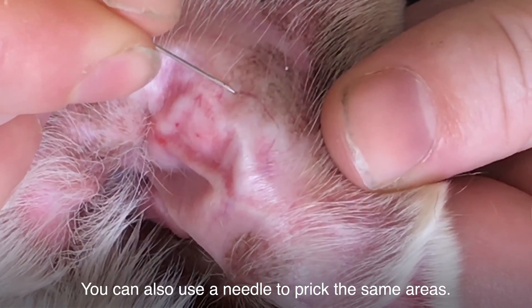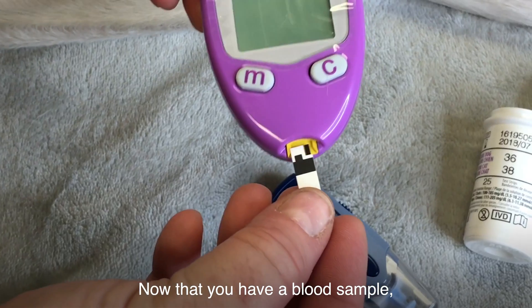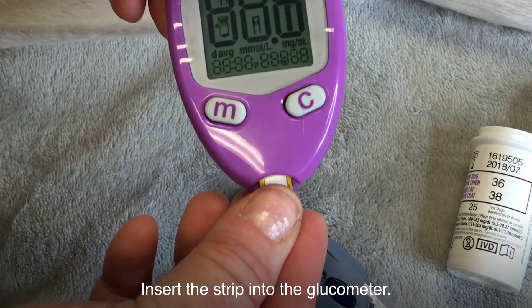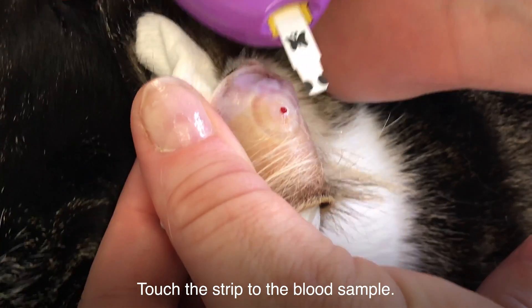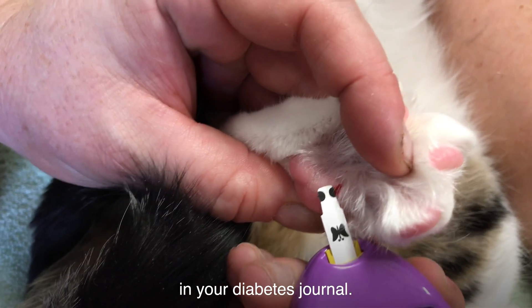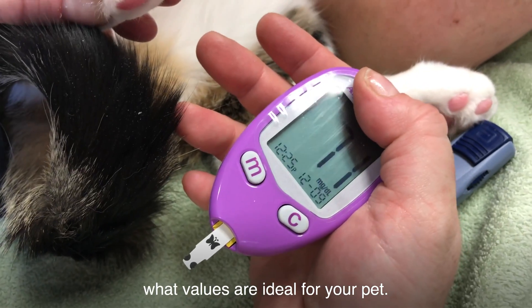Apply firm pressure. You can also use a needle to prick the same areas. Now that you have a blood sample, it's time to use the monitor. Insert the strip into the glucometer. Touch the strip to the blood sample. Wait for the value and record it in your diabetes journal. Your veterinarian will help you determine what values are ideal for your pet.